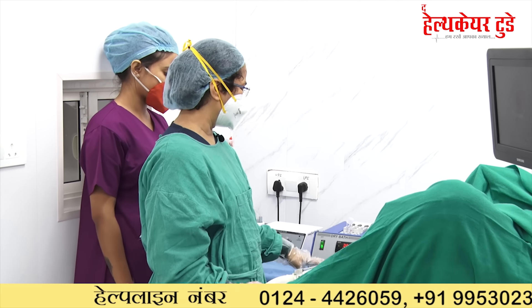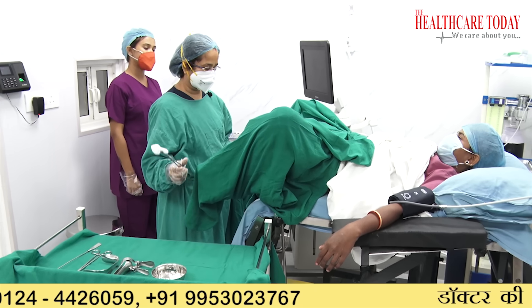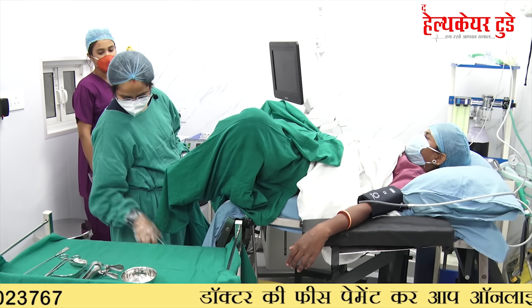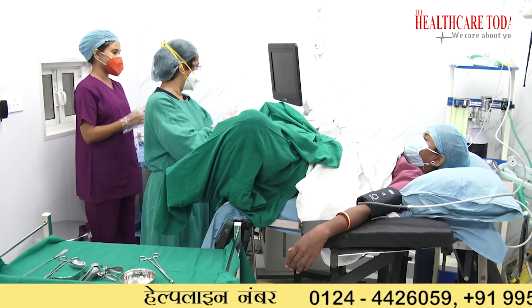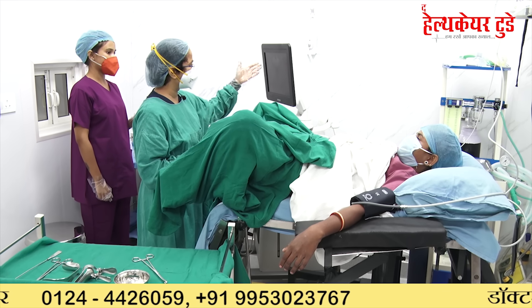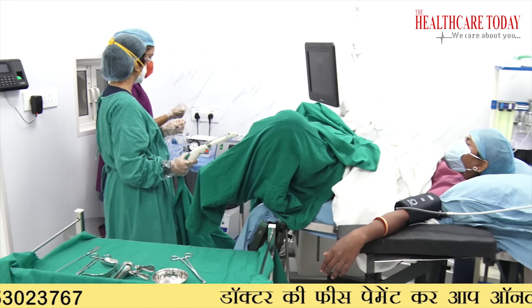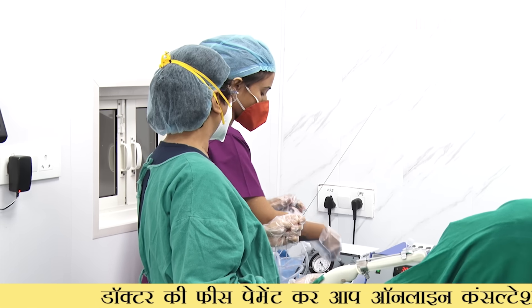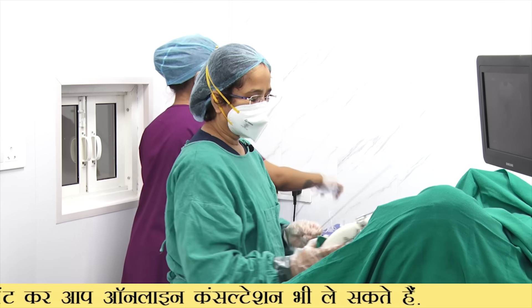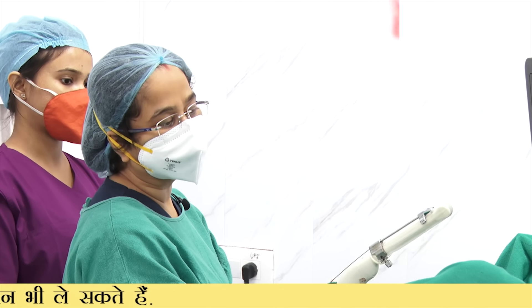Now we clean the vaginal wall. After cleaning the vaginal wall, we connect the probe with a suction pump and put the needle through. We need to make sure that the needle is clean so we don't have any infection.